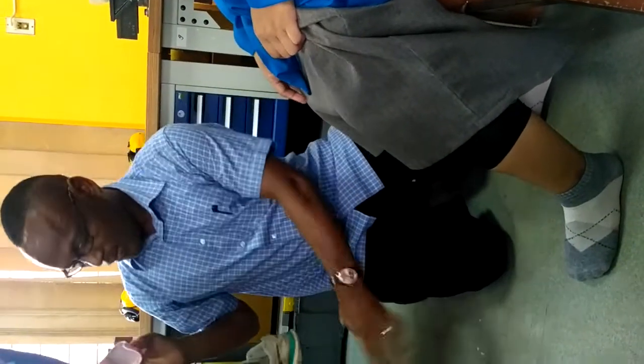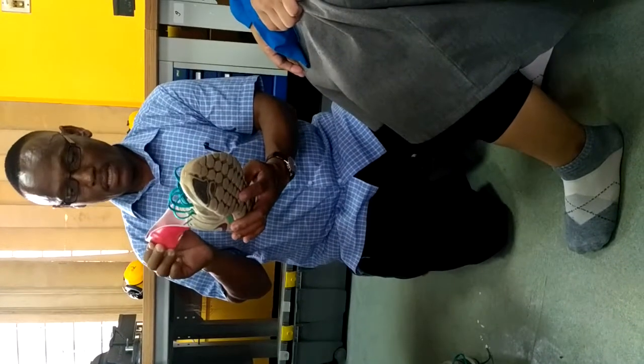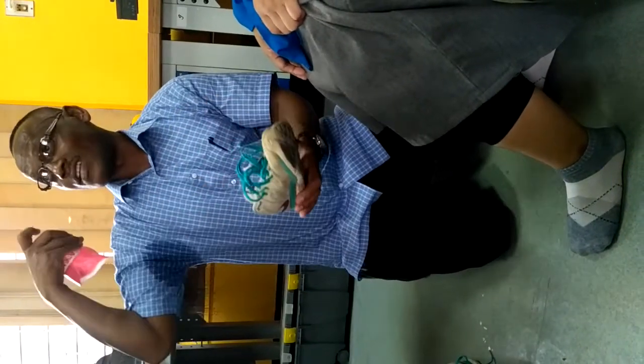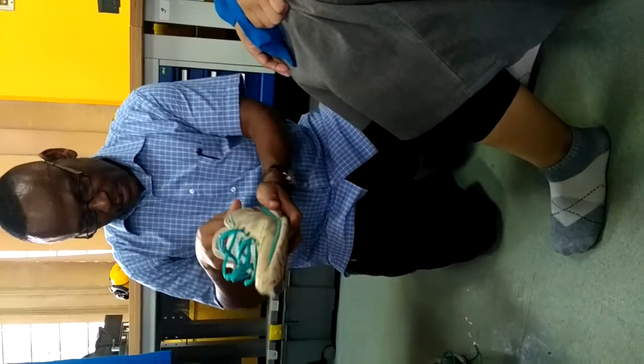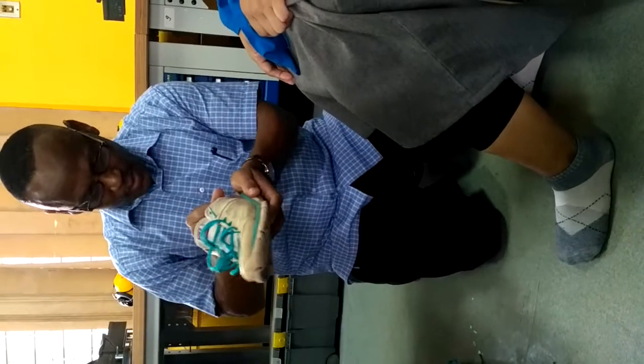Standing is done. I am going to do the last stage to be dynamic. I am going to put in the device — it is a shoe, but you have to remove the original insole. Put it in. And then you can ask the patient. Then you have to explain: the orthosis is still fitting very well.